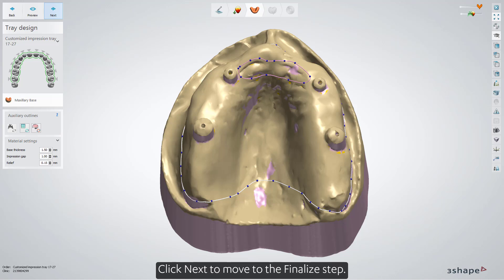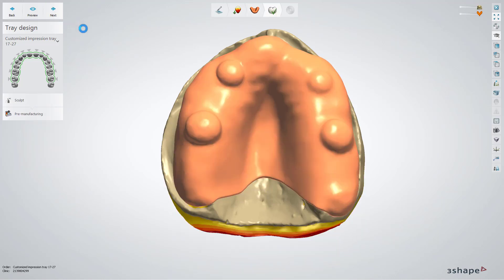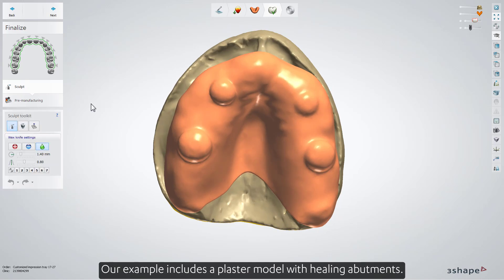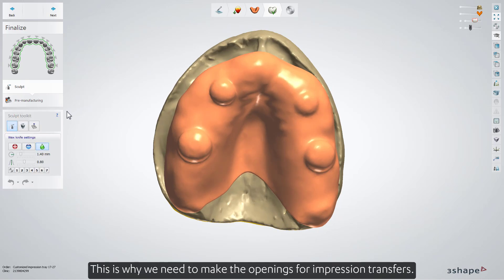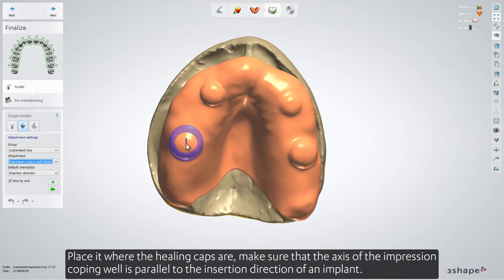Click Next to move to the finalized step. Our example includes a plaster model with healing abutments. This is why we need to make the openings for impression transfers. To do that, from the Attachments menu, we will choose Impression Coping Well Global. Place it where the healing caps are.